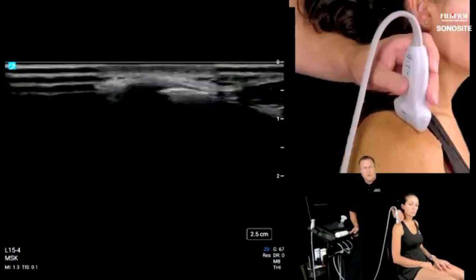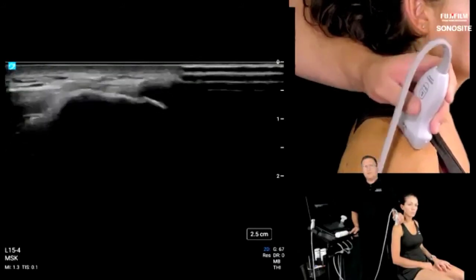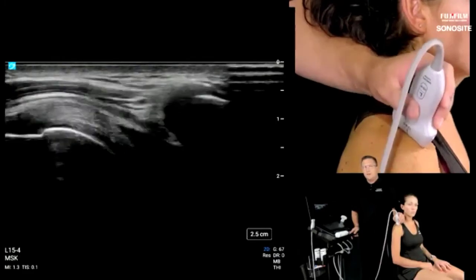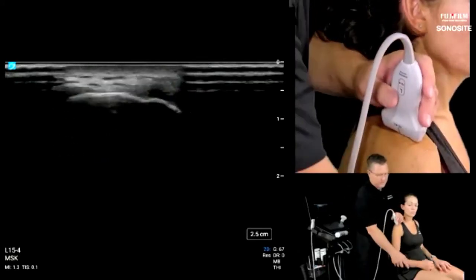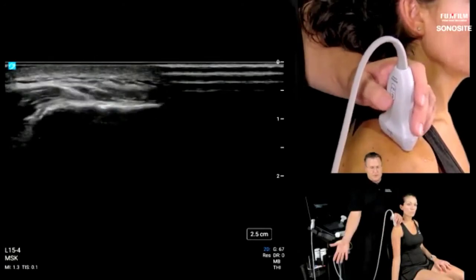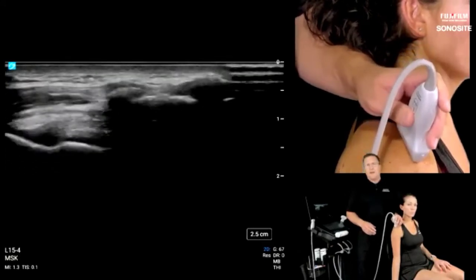Absolutely. So as I mentioned right when we got started, find that acromion process right there and move laterally until you see that humeral head. When we see the humeral head, you want the acromion in the shot as well, so that can be a little tricky. I find that getting the impingement maneuver, if you're trying to scan based on traditional anatomical location, which is the palm forward, the greater tuberosity does go more lateral and makes it a little easier to find if you're looking at an anatomy reference.